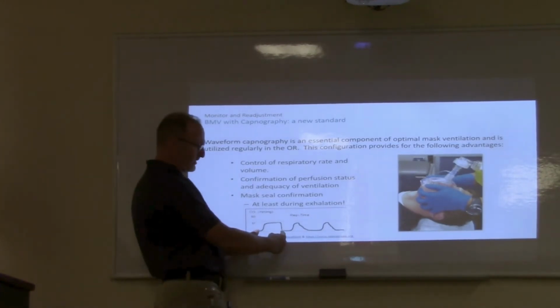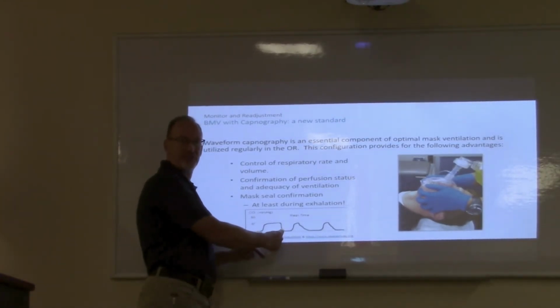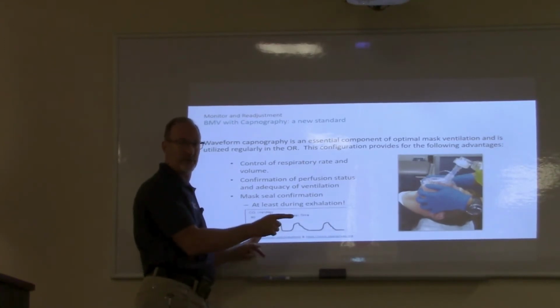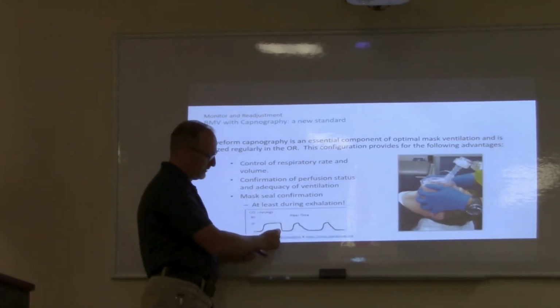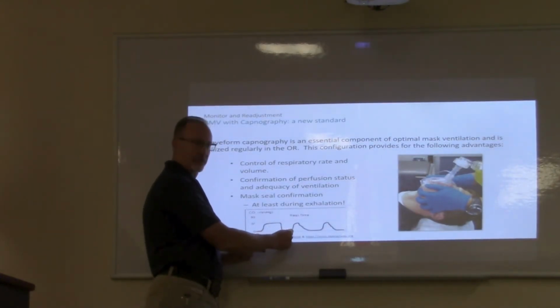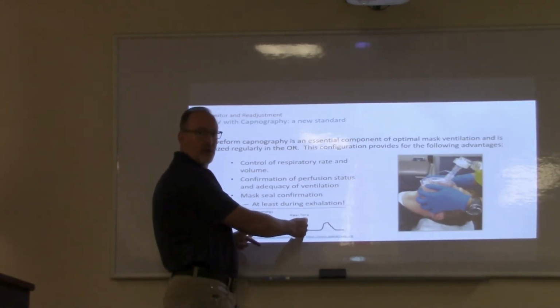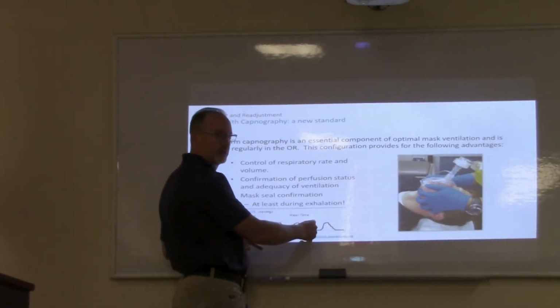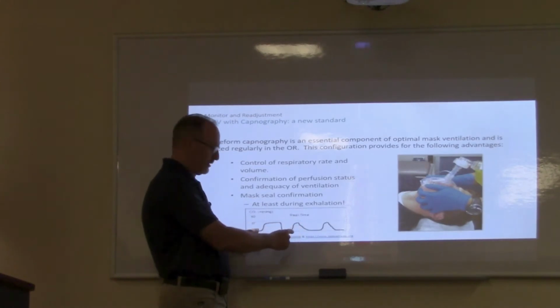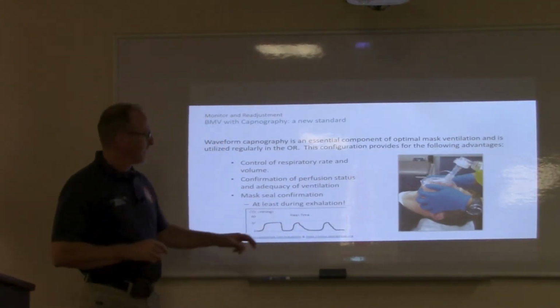And the distance here, this is the reminder, since we're looking at end tidal CO2, this is when we're breathing out. So this is exhalation, this is inhalation. Exhalation, inhalation, one respiratory cycle, okay? So this can be a long exhalation, this could be longer, but still a square waveform. Shorter, still what we call a square-ish waveform.